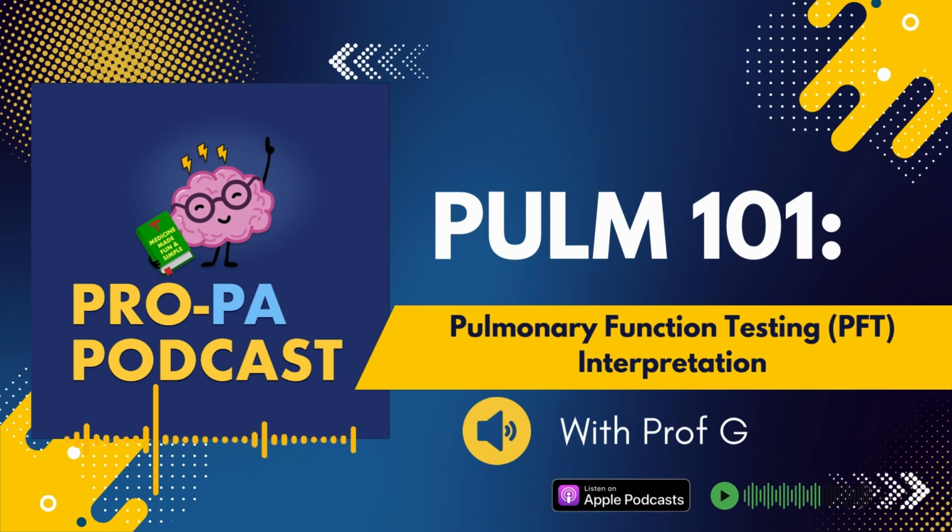For the simplicity of this podcast, let's go with greater than or equal to 70%. If the FEV1 to FVC ratio is low, this indicates an obstructive process like COPD or asthma. So, this is the very crucial first step. Is the disease obstructive or normal, non-obstructive?